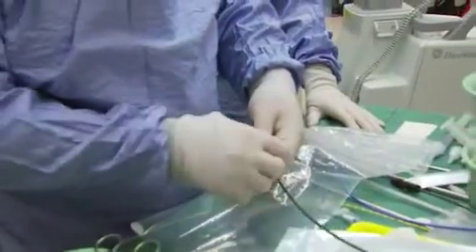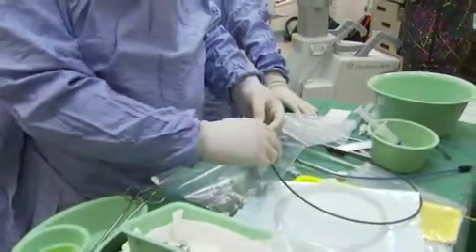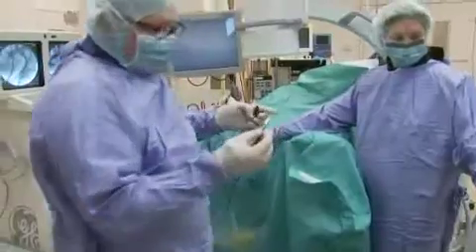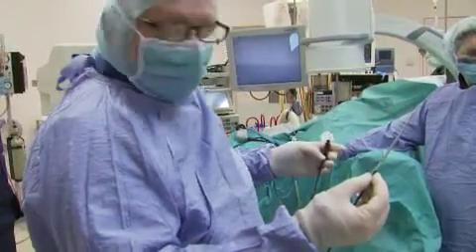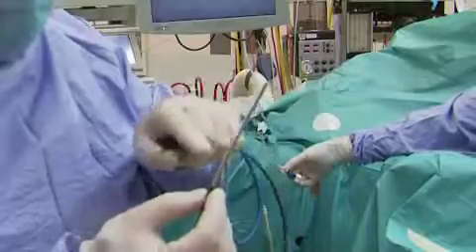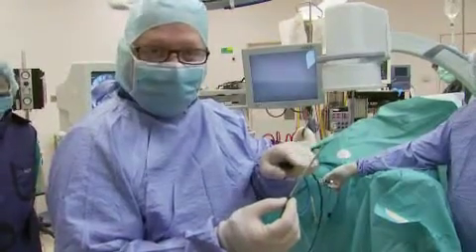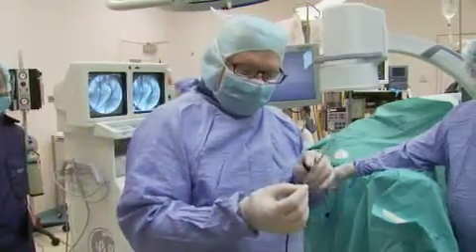Now we are ready to deliver the Memokath dual cone. We need to open up the clips that hold it in place. I just want to show you here the Memokath dual cone. This is the metal component of the stent. Once the hot water passes through and the stent expands, then this component will be removed.